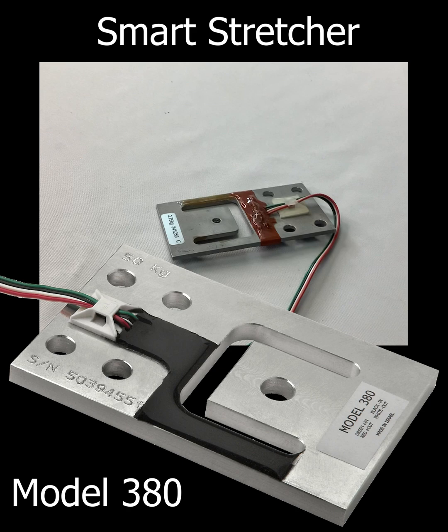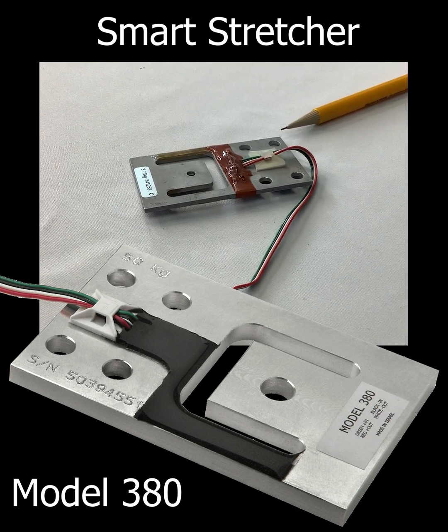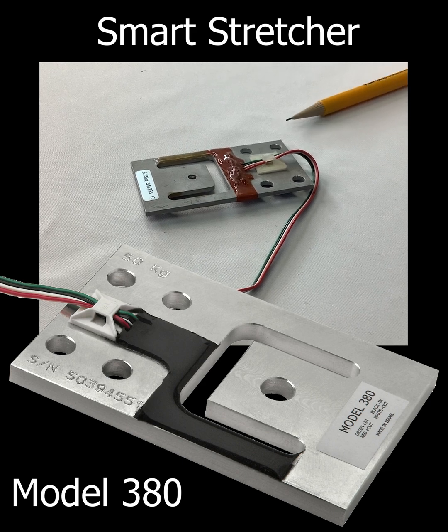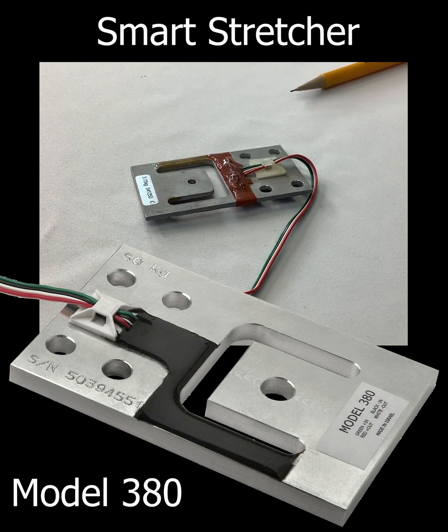This is our Model 380 planar beam. This is a small version. We make a larger one that goes up to 200 kilograms. 150 kilograms is a very popular capacity for stretchers and beds.